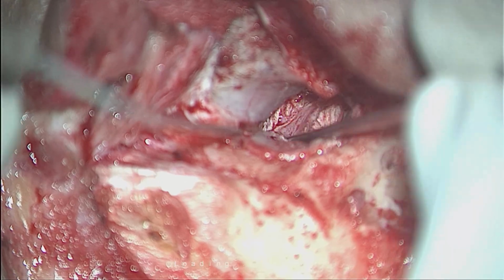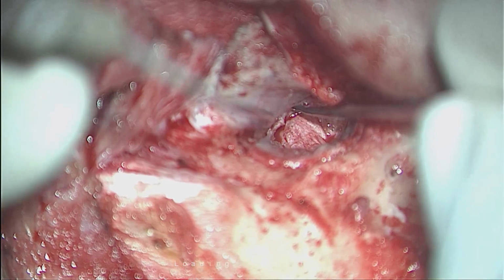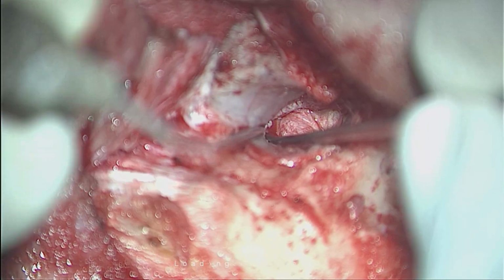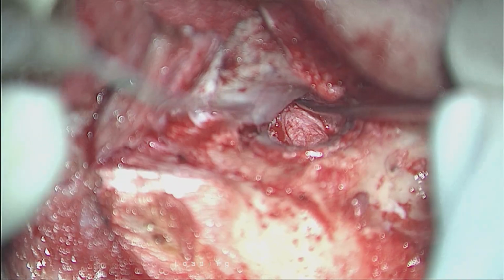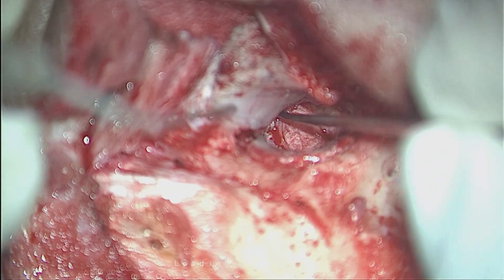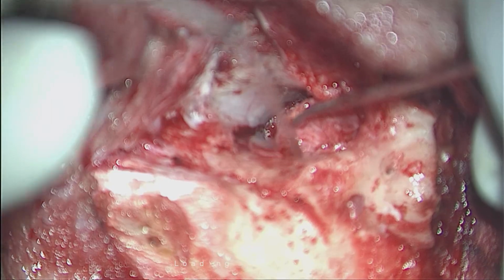Much better. See this? Your graft is sitting on the mucosa. Everything follows your orders. It depends how you are used to. So this is why I always propagate, because of the dry graft. You are placing the annulus back in the sulcus. See this? Annulus back in the sulcus.